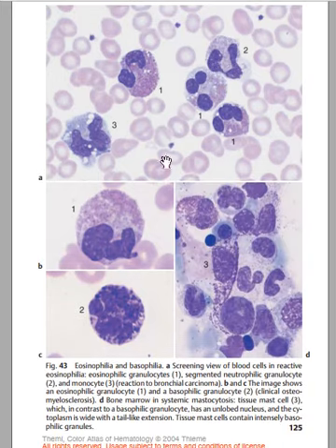The screening view of blood with reactive eosinophilia and eosinophilic granulocytes is scanned. Diagram A shows that eosinophils normally have a 2-lobe nucleus, and you have many pink granules inside. That's an eosinophil. So this is going to be much increased in circulation. Basophils also have a 2-lobe nucleus, and you have basophilic granules. Is it clear? Now you have segmented neutrophils.